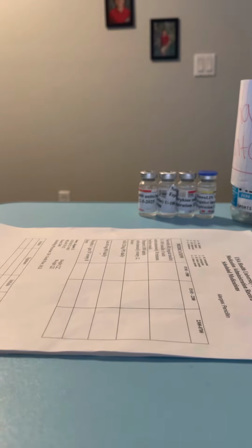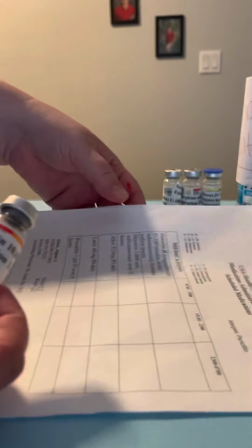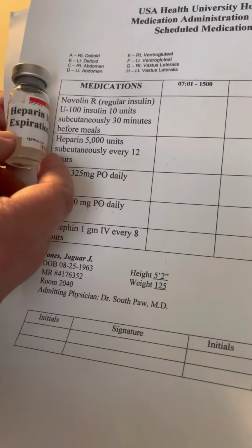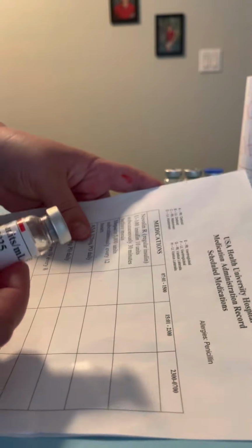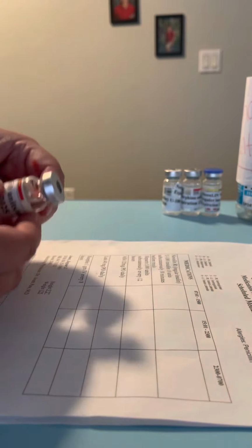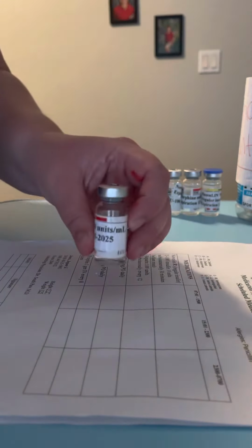All right, so now I'm going to perform hand hygiene. Make sure I grab the correct medication. So I have heparin. I'll compare it to my MAR. So it says heparin and heparin. The order is 5,000 units, and this says 10,000 units per milliliter. And since 5,000 is half of 10,000, we're gonna do half of a milliliter. And the expiration date is 12/5/2025. It's not expired, so it's good to use.